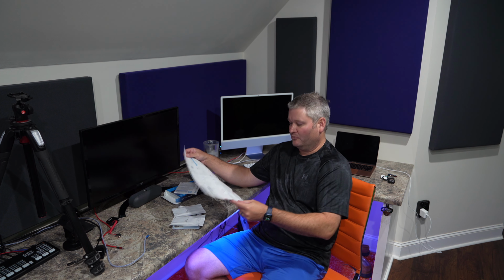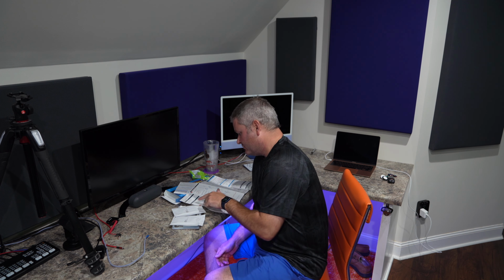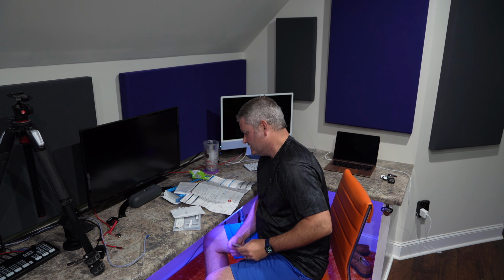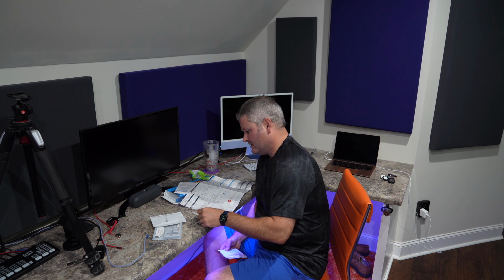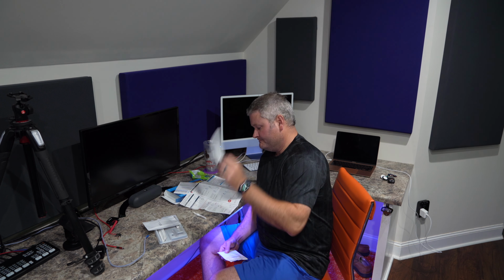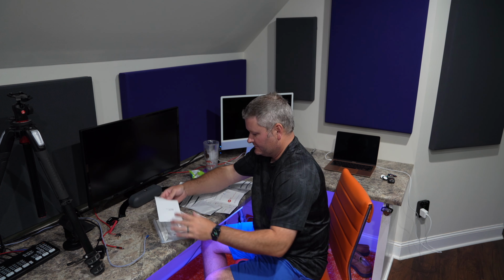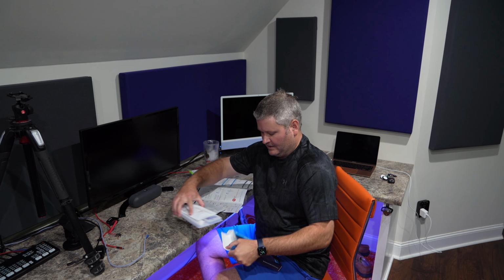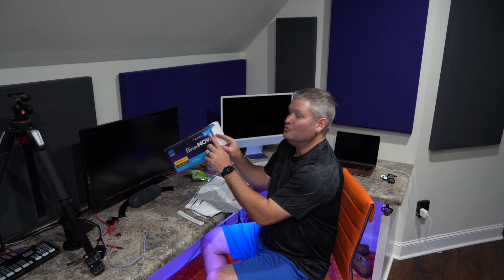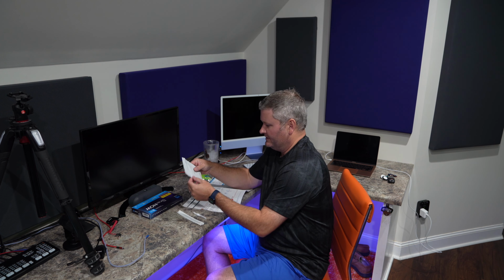Prepare for the test. Wash or sanitize your hands. Make sure they are dry before starting. As I mentioned, everything is dry and I'm sanitized. I'm not around anybody else. Preparation for the test: test card in pouch, dropper bottle, or this little doohickey right here. I'm going to use this doohickey. I'm going to use one swab, this, and a timing device. I've got a timing device on my wrist. So we're going to put the rest of this away. We know we don't need any extra. I'm just doing one test. This contains two tests. So we're going to open this.